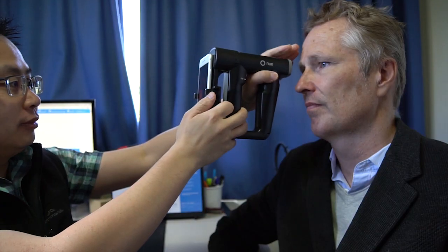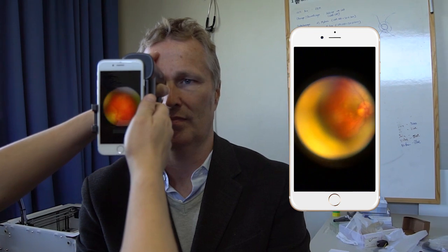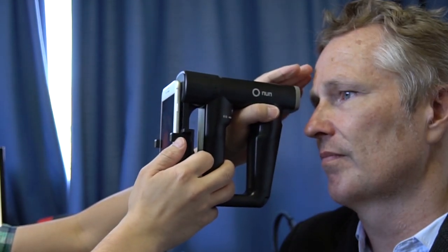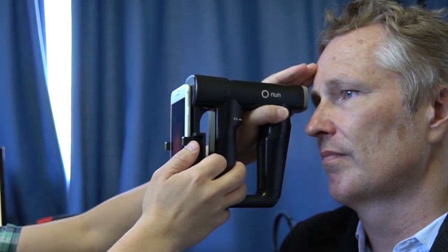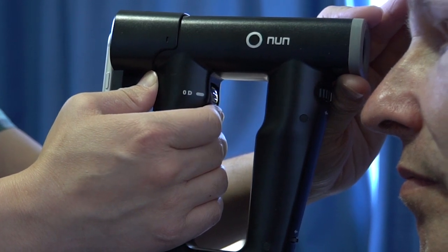Sit around 15 degrees to the side of your patient. Instruct the person to look straight ahead or stare at your ear. Start at around 10 centimeters away from the patient. Find the red reflex of the retina and make sure you are well-centered. Then slowly and steadily move towards the patient's eye. Adjust the focus wheel until you get a crisp image of the optic disc.